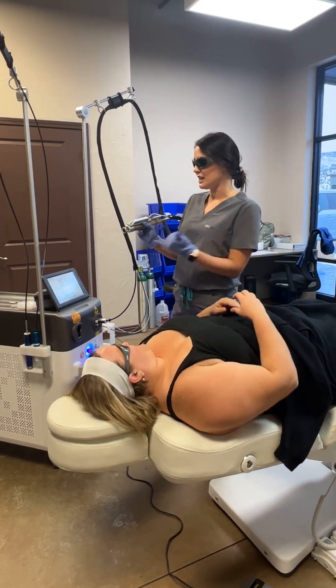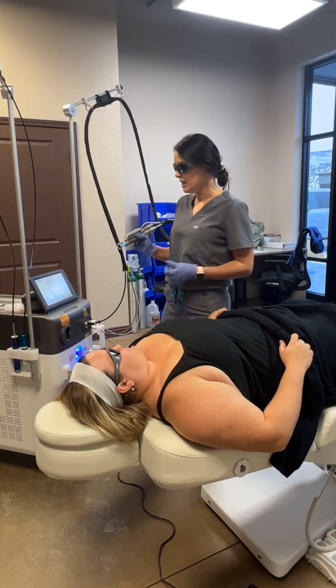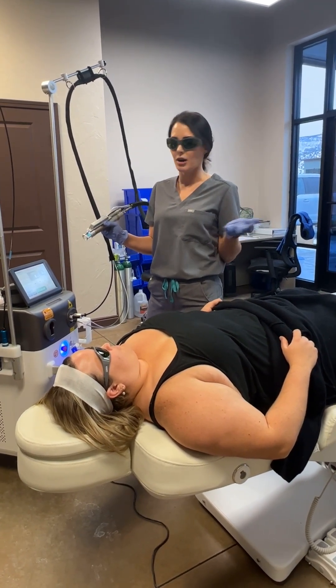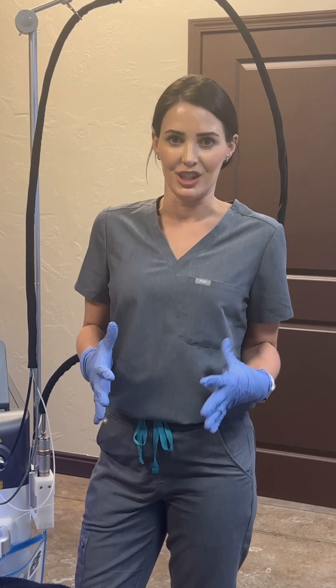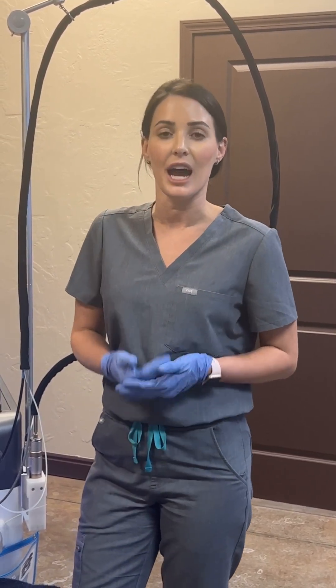To clean this device, all you need is 99% alcohol or any alcohol — usually 70% is my go-to because you can wipe everything down. You have a Q-tip and you just clean the inside. You can even use ethanol or 99% isopropyl alcohol. This device can do many other indications such as pigment, freckles, whitening, toning, and it has a melasma treating protocol. This device actually has data on how to treat melasma.